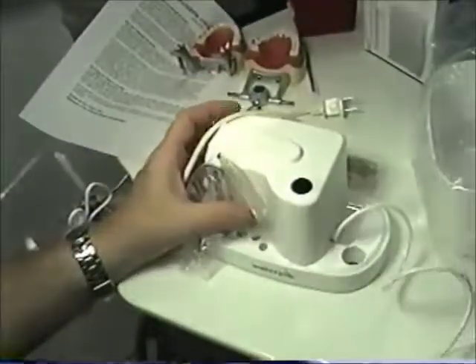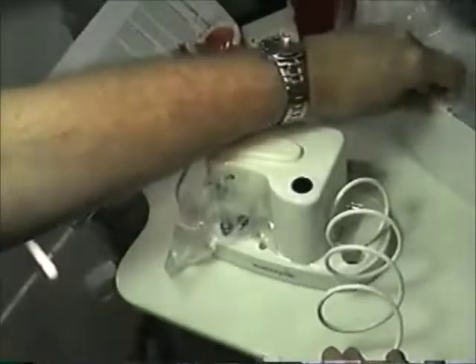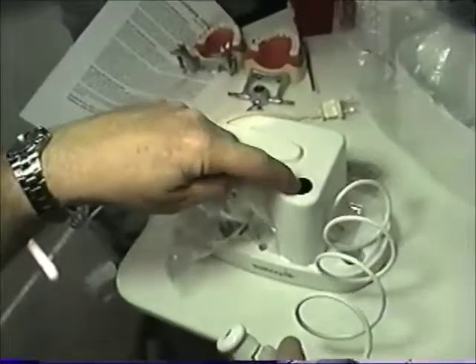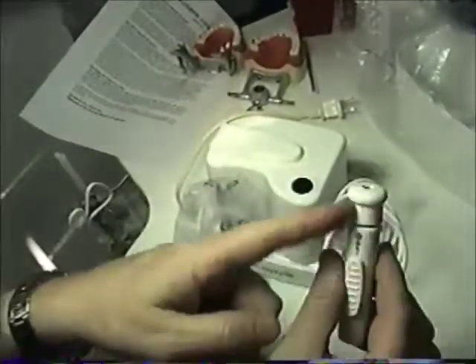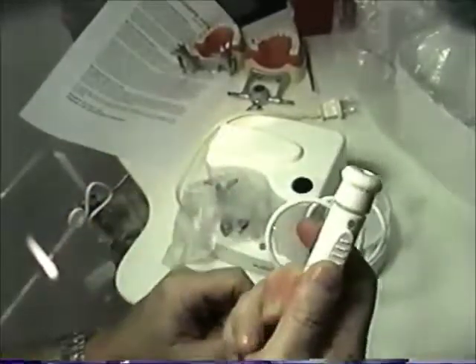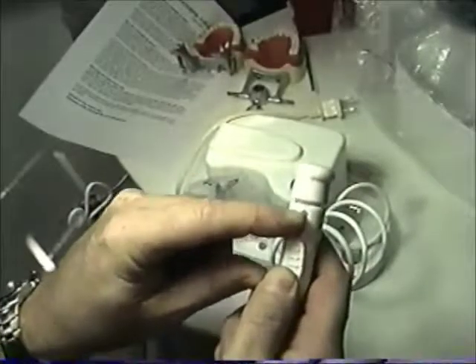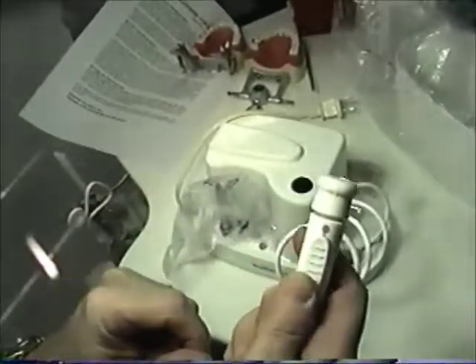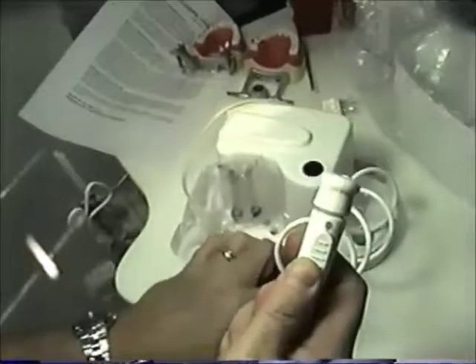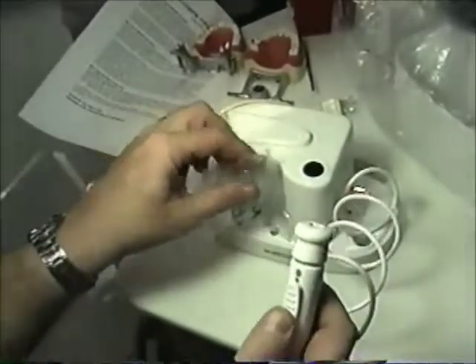And it comes with a cord. So the tub actually sits up on top of here. And when you set it up on top of here, the water goes in here, comes through here, and the machine shoots it out through this. And this controls how much. You can see a little drop or big drops on here. There's a little diagram, like that's fully on. When you first use this, I probably wouldn't put it all the way on. I'd probably back it off a little bit till you're used to it.